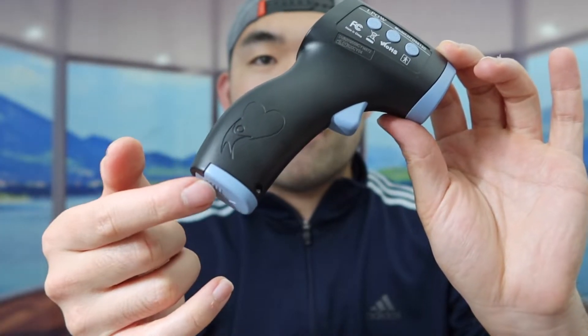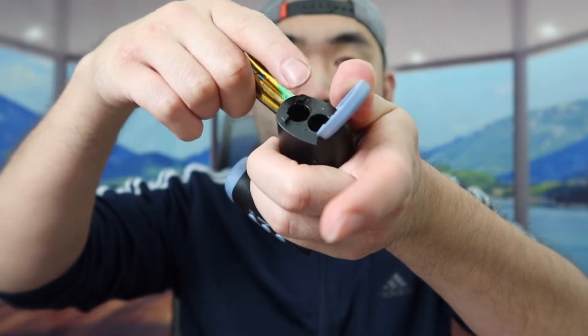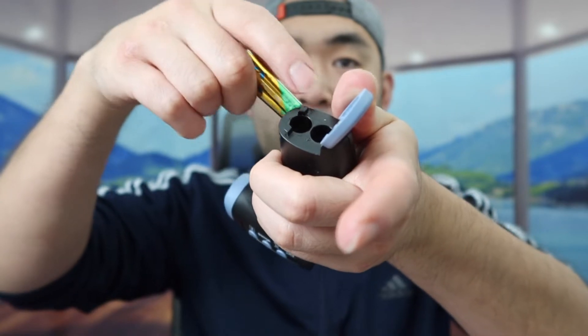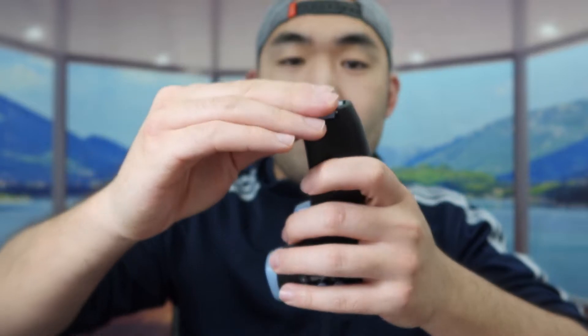Let me open the bottom to put in the batteries first. So we want to put in two AAA batteries inside, and they do label on here to let you know which side to put them on — plus and minus. So just like that. If you guys press on the button right here, you can see it does turn on.